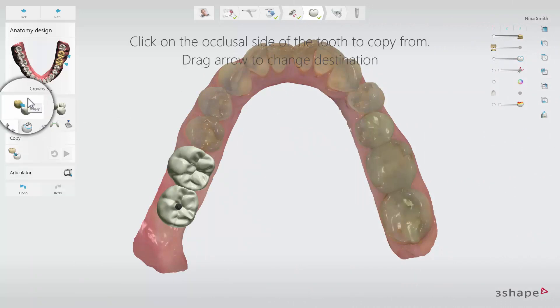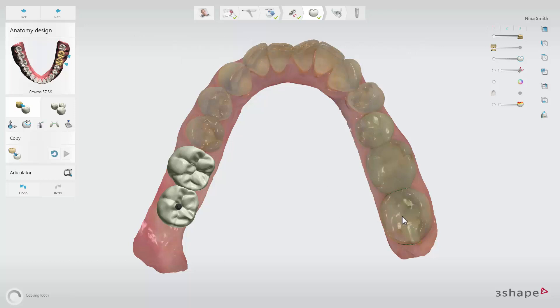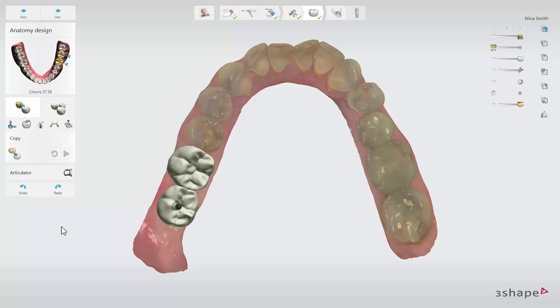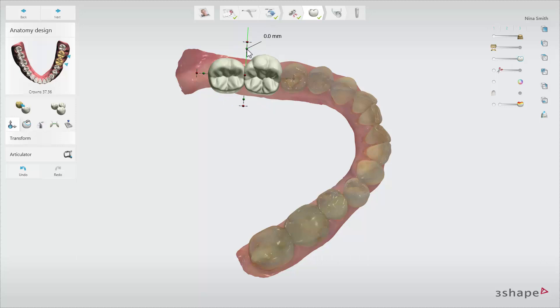Click on the Copy icon, then click on the occlusal side of the tooth you wish to copy. The software will design the virtual crown based on the tooth you chose. You can adjust the crown if needed. To modify the crown shape or position, use the Transform tool, which is selected by default once the crown has been placed.